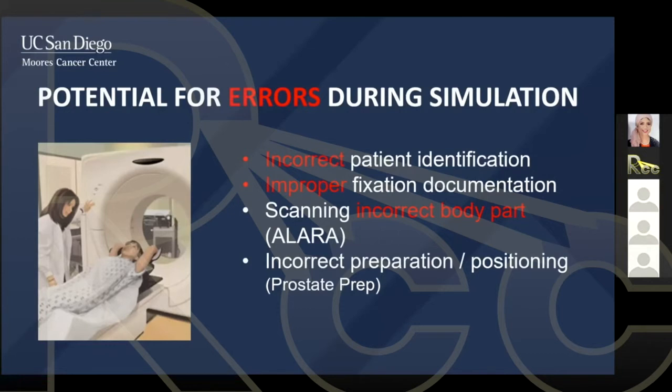And then this brings up the issue of ALARA, which stands for as low as reasonably achievable. Essentially, if you don't have to give any radiation dose to the patient, you shouldn't be doing that. Extra dose is just completely unnecessary. It should be avoided at all costs.